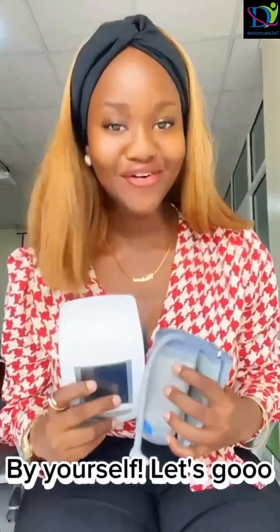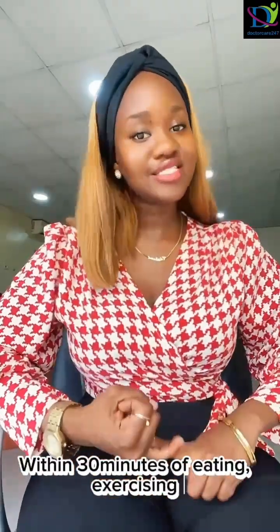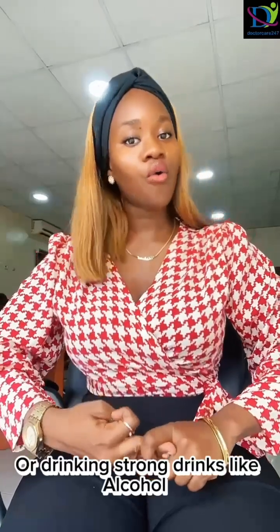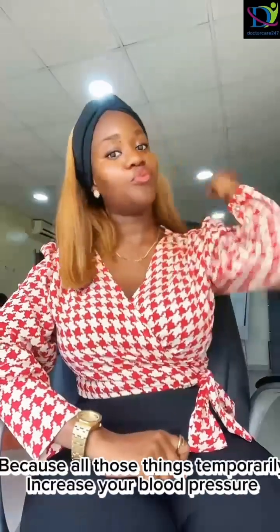So let's go. First things first, tip number one: make sure you don't check your blood pressure within 30 minutes of eating, exercising, or drinking strong drinks like alcohol, caffeine, or even smoking, because all those things temporarily increase your blood pressure and we don't want that.